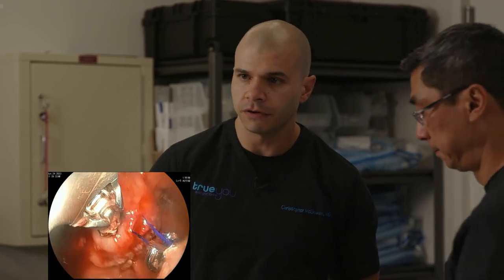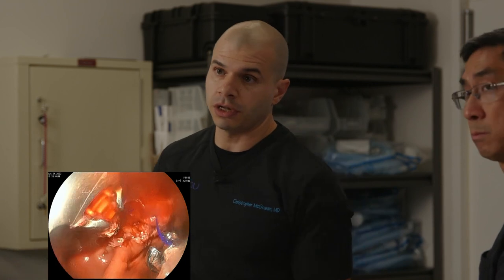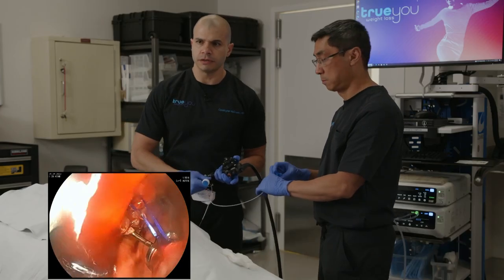We have to be in very close contact because the risk would be early on. But the nice thing here is we're working directly inside. At the conclusion of the procedure, I'll know if there's any residual bleeding. We'll know how things look, and then we can feel really comfortable with this. I'm actually going to go ahead and cinch right here.